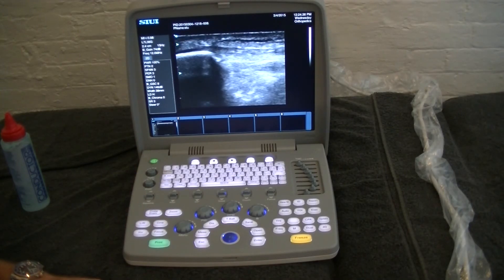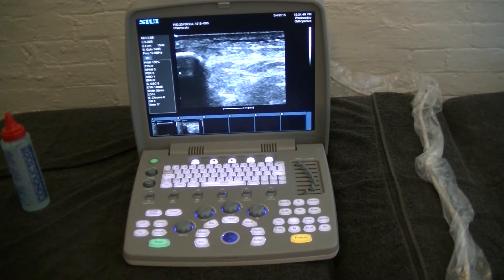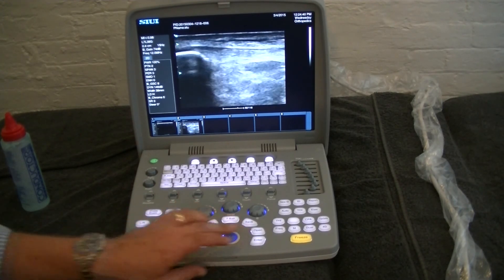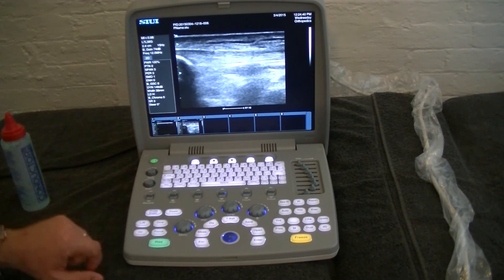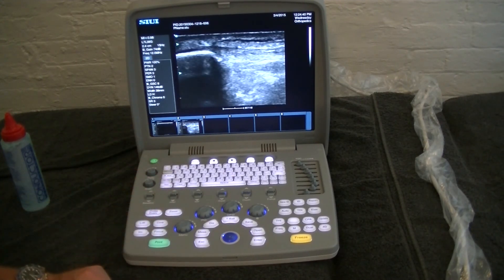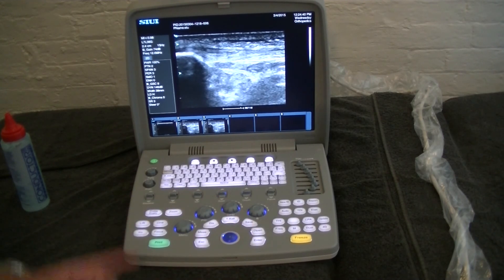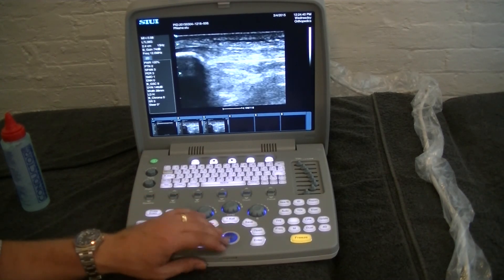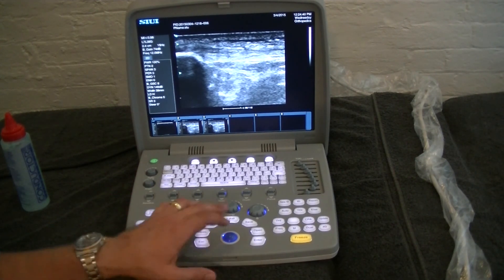If we want to save an image, all we have to do is hit save and we'll get our thumbnail down the bottom of the image. We can also hit the Cine button, which will play back a certain amount of frames that the unit saved, and we can save that Cine file so we can go back and have a look at it later.